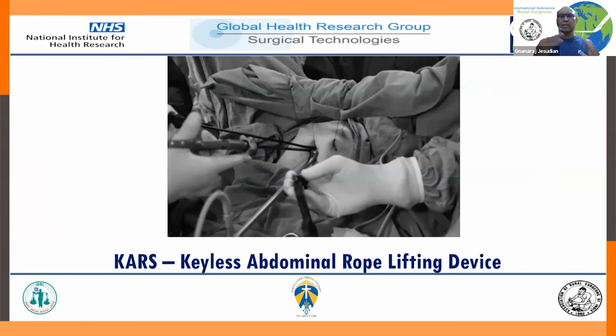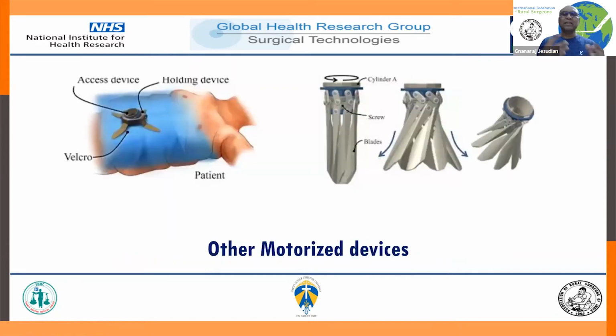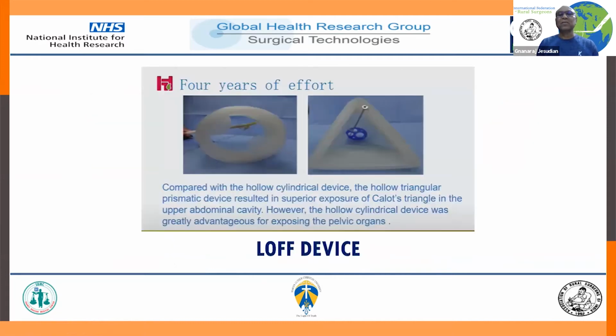And this is the next stage where they had a flat thing in the front, and also to provide additional lift, these sort of wires were used. But again, although it is an improvement from the original devices, it is not comfortable to operate with. And again, it takes a long time to set up all this equipment. Then the next stage, of course, is they went on to the motorized devices, which are better, but then again, not as good to replace conventional laparoscopic surgeries. This is another device where there's a balloon and you operate inside the area.